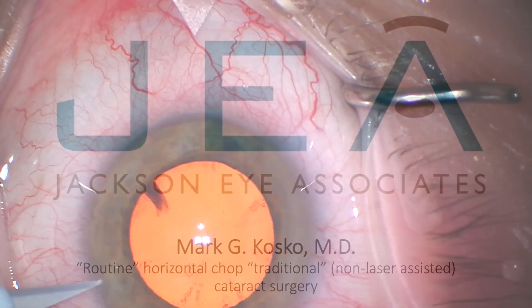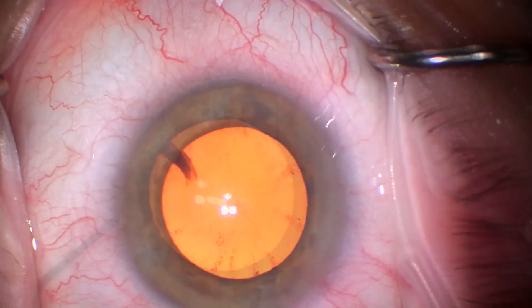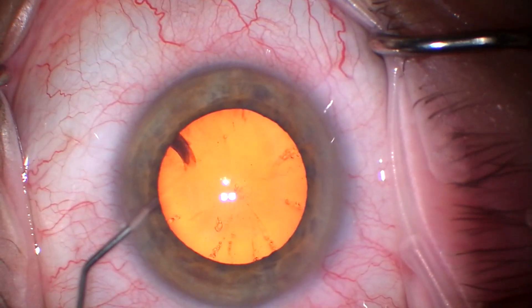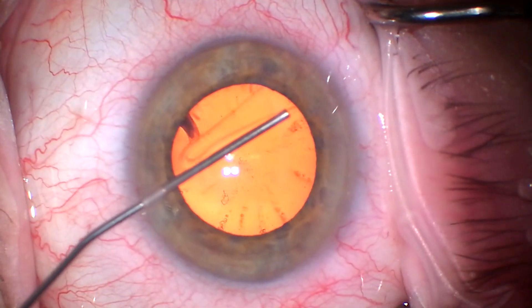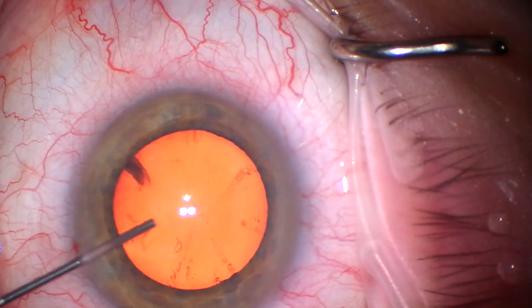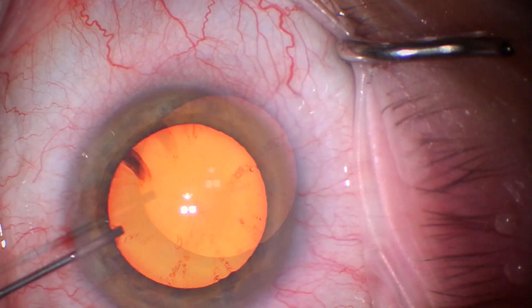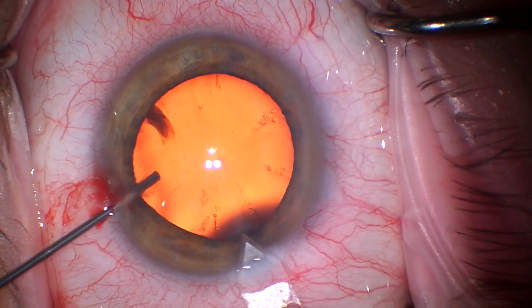This is Mark Cosco. I'd like to share with you a video of a routine cataract surgery using horizontal chop techniques. This is a lady with a previous high myopic LASIK with advanced low-tension glaucoma.